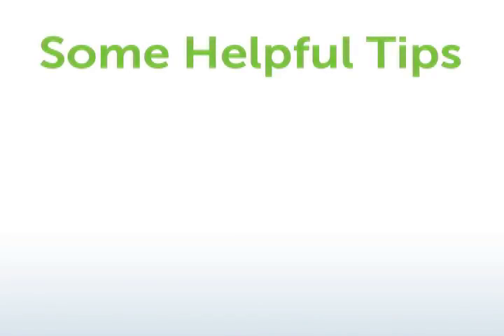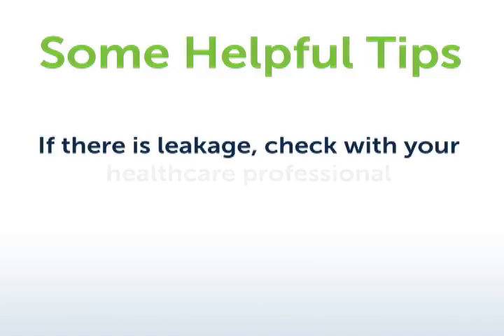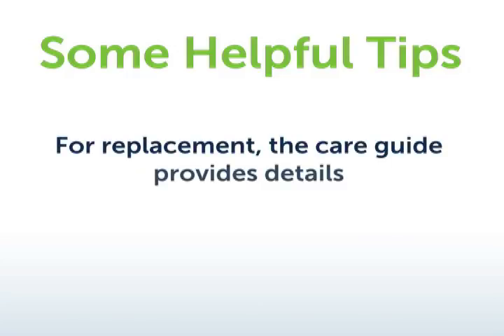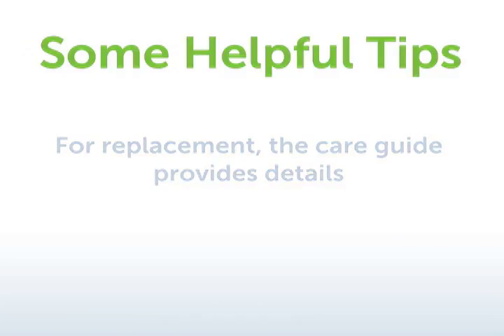Here are a few tips for situations and questions that may arise as you get used to the Mickey feeding tube. If there is leakage around the tube, this may indicate that the feeding tube has become improperly fitted or that formula is being delivered at too high a rate. Check with your healthcare professional to determine the exact cause and remedy. If your doctor recommends replacing the Mickey feeding tube, the care guide provides detailed instructions. Occasionally, the balloon may break, allowing the tube to become displaced. If this happens, contact your doctor immediately.